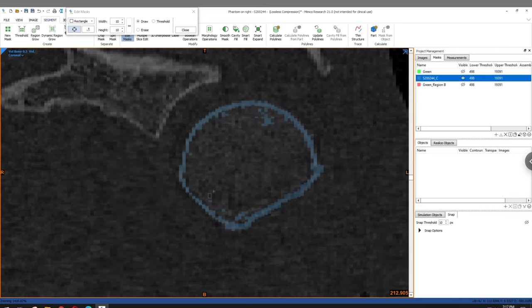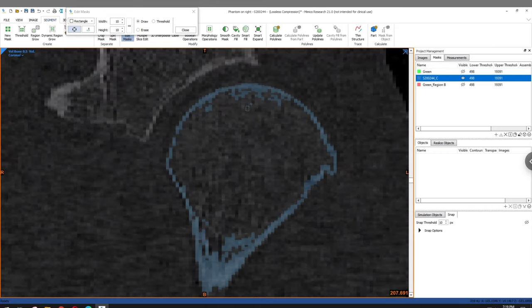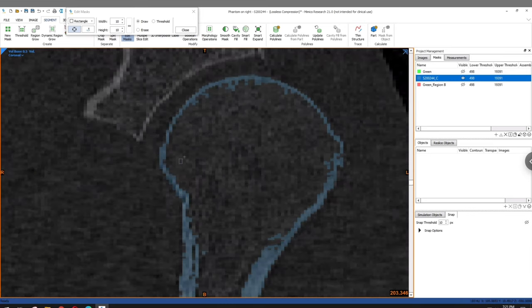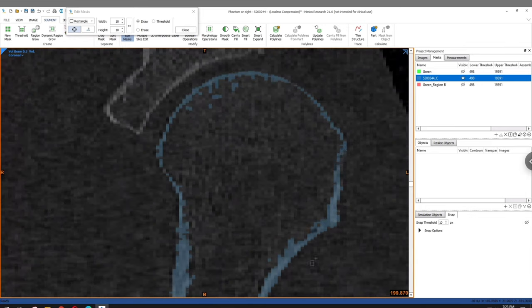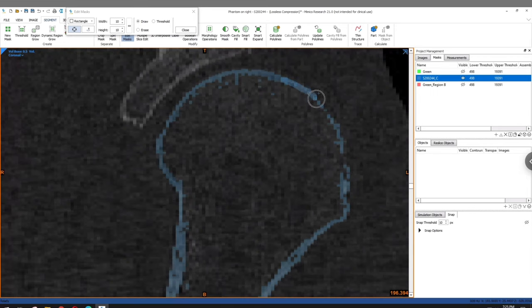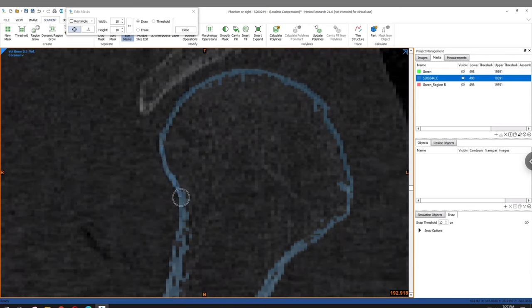Unfortunately, as you can see here, it will be relatively time consuming to complete each individual slice image. To ensure that your segmented cortical shell is complete, you can probably allot, at least in my case for a humerus, 45 minutes to an hour for this process if you're doing it correctly and trying to make a thorough 3D model of a cortical shell differentiated from a trabecular interior.